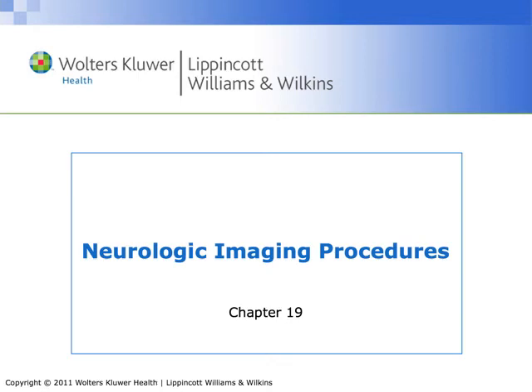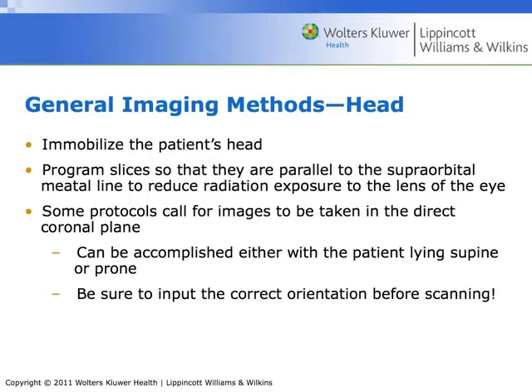Okay, let's discuss neurological imaging procedures. So it's important that we immobilize the patient's head before we do any kind of imaging. We want to make sure that we inform the patient they need to hold still.